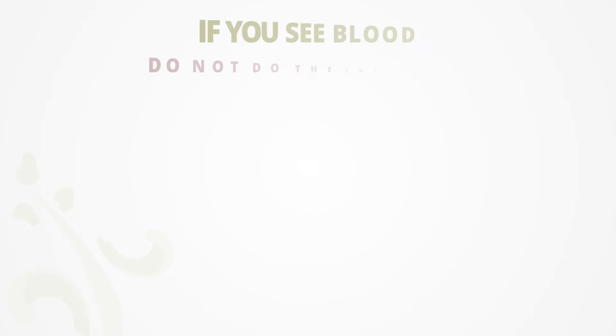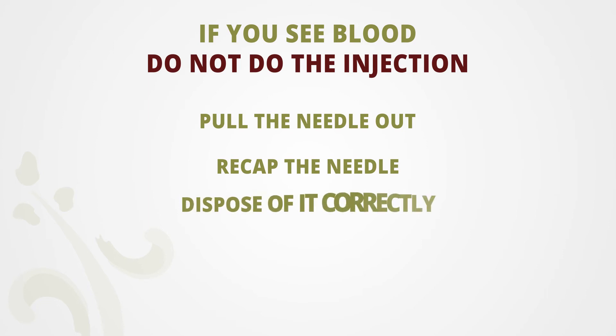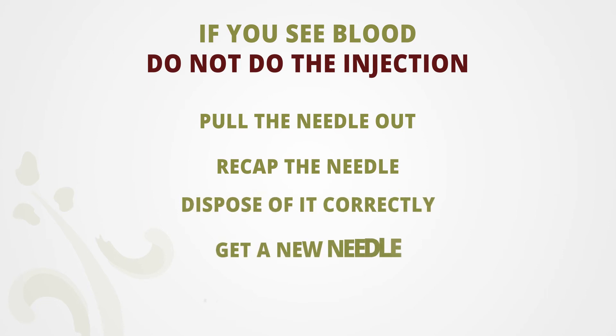In the case that there is blood, we will not do the injection. You will pull the needle out, recap it, and dispose of it correctly, get a new needle, and redo the process.